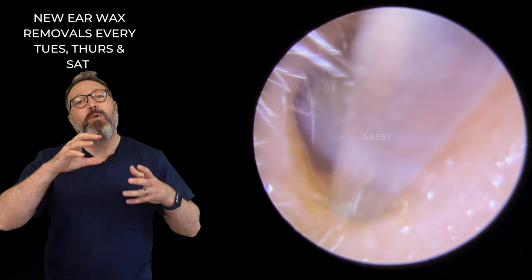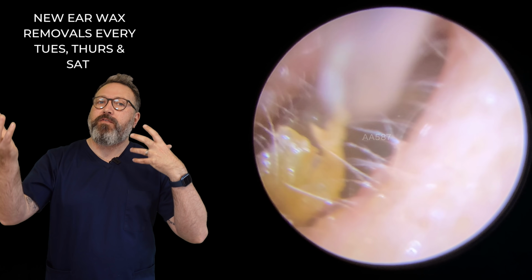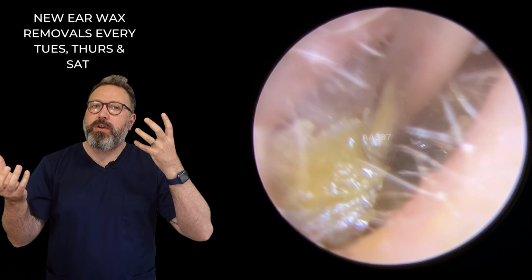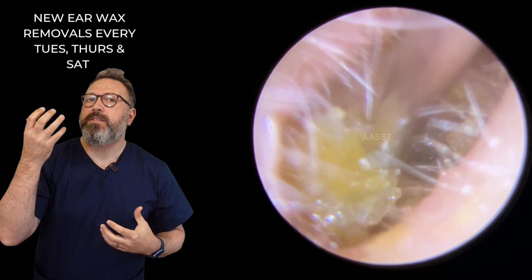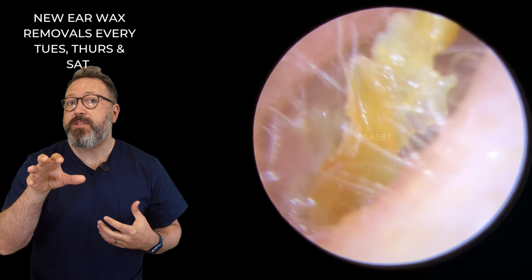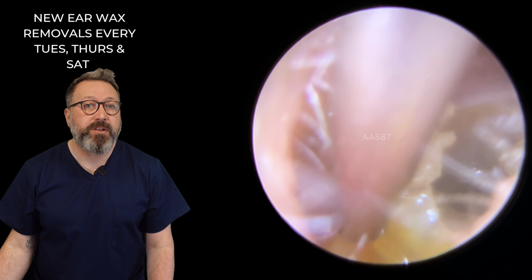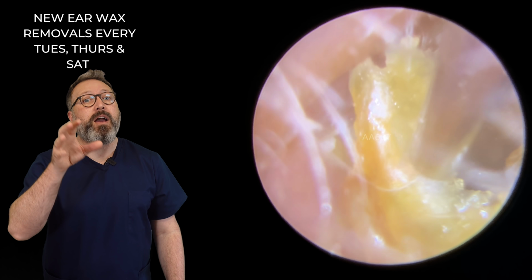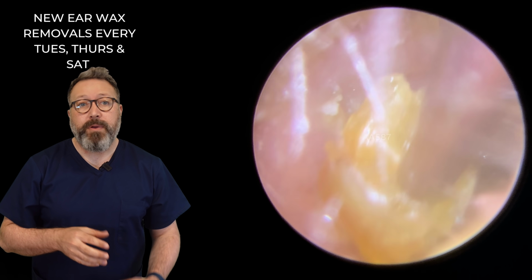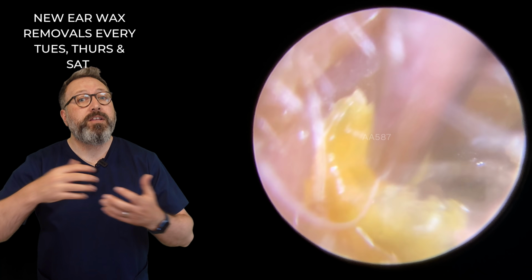But you can see how we had a patient in one of the previous videos where there were very different ear canals on both sides. So you end up with very dry skin on one side and then skin that had moisturized on the other. So what we're doing with the olive oil here is actually moisturizing the skin. Now we're not talking about putting it in, leaving the patient for 20, 30 minutes and coming back. This is literally a minute. You're popping this in, patient tilts their head over to the side to allow the oil to work its way down, and then you carry on.